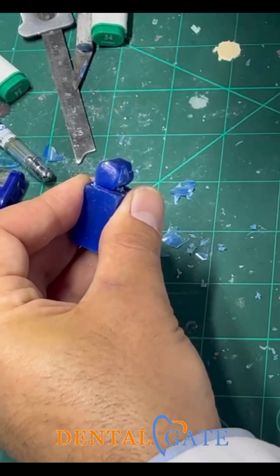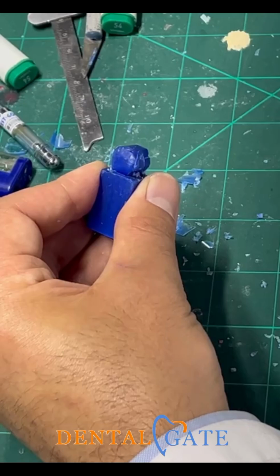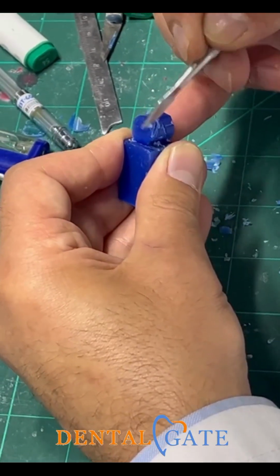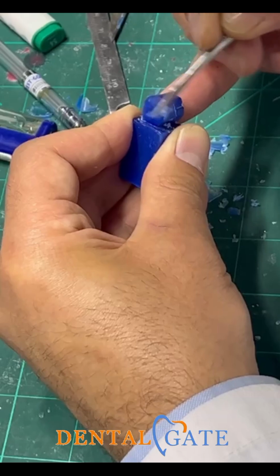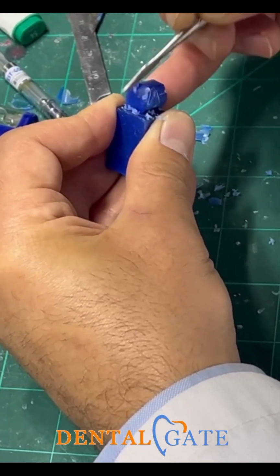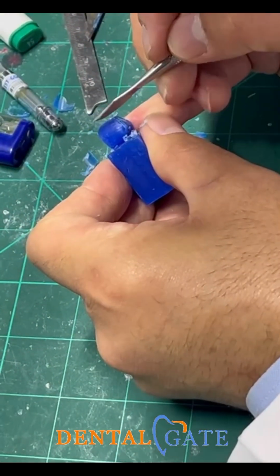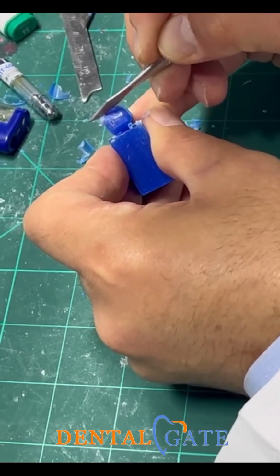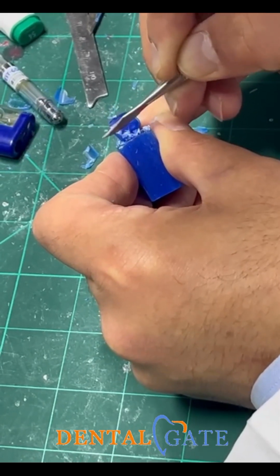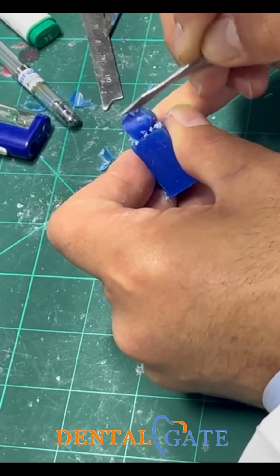But when you increase one proportion on this side, you may need to increase on the other side. So I need a severe tapering toward the top of the block. But equal slicing, please, equal slicing, to produce one surface, one parallelism, one shape.